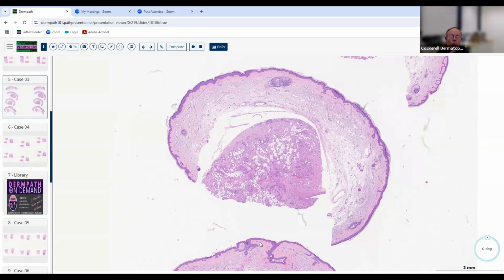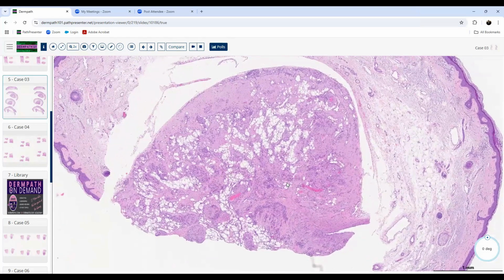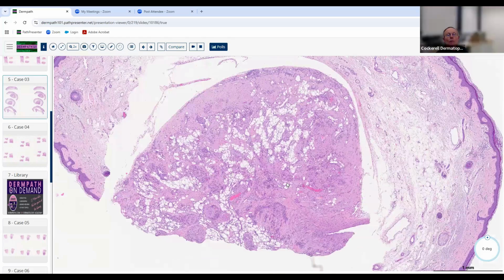Okay, so the next step, obviously, is whether it's going to be epithelial or non-epithelial. Yeah, so this one, I am favoring non-epithelial. Good, non-epithelial. And we like to keep things very simple in dermatopathology. The simpler, the better. So what are the three main non-epithelial cells that we look for? We can look for smooth muscle cells. Good, smooth muscle. Histiocytes or fibroblasts. Good, fibrohistiocytic.